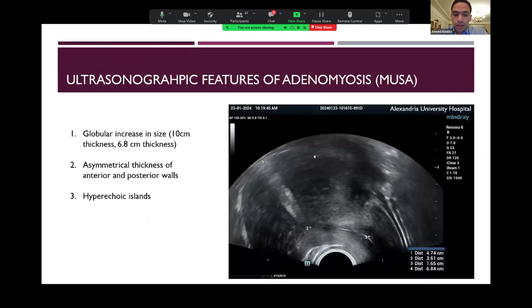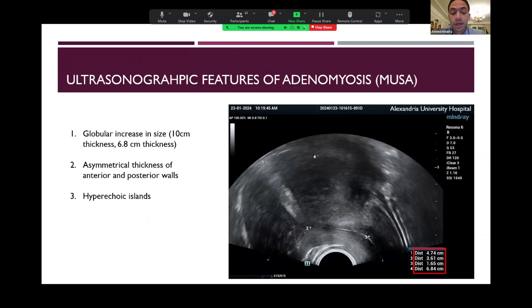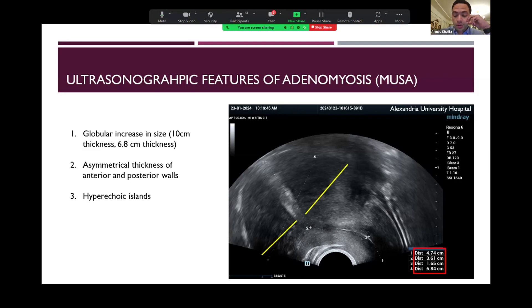In this patient, you can actually spot three of these criteria. As we can see here, there's a globular enlargement of the uterus. As we can see in the dimensions, the uterocervical length is 10 centimeters and the thickness is 6.8 centimeters, which is considerably larger than the normal dimensions. There is asymmetrical thickening of the anterior and posterior wall, and we can also see hyperechoic islands here. These are all signs of an adenomyotic uterus.